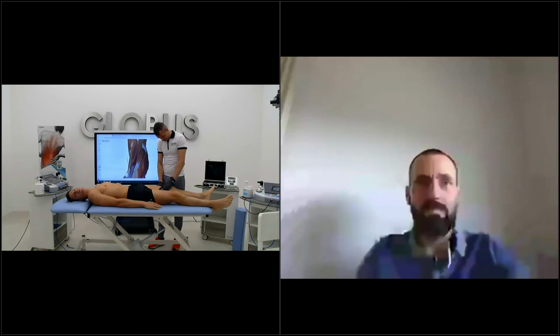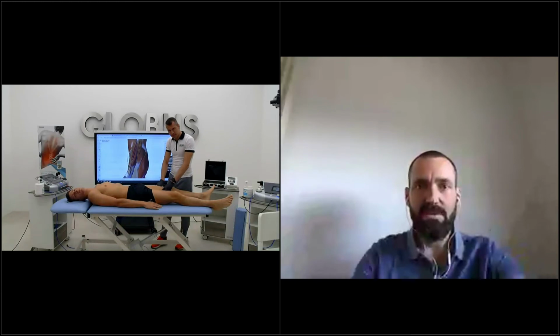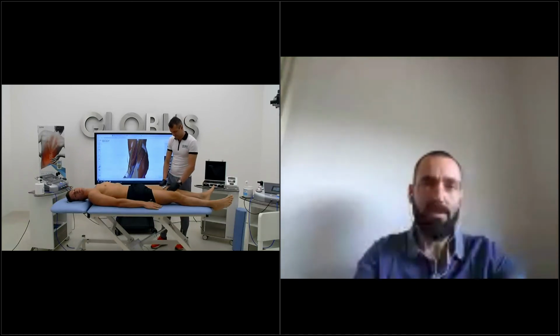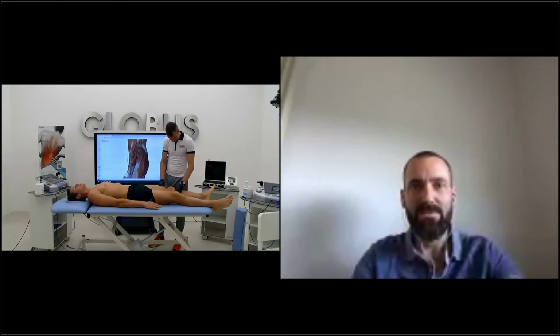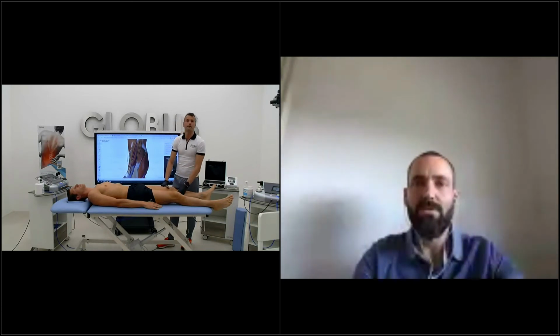Yeah, groin pain. As I understand, there was a question about the possibility to use this in groin pain. My answer is yes, of course, but it depends on the cause of the groin pain, because when you speak about groin pain or pubalgia, we have several different causes. So as I said before, in the evaluation we understand when this groin pain or pubalgia starts, and then we can decide which technique to use.